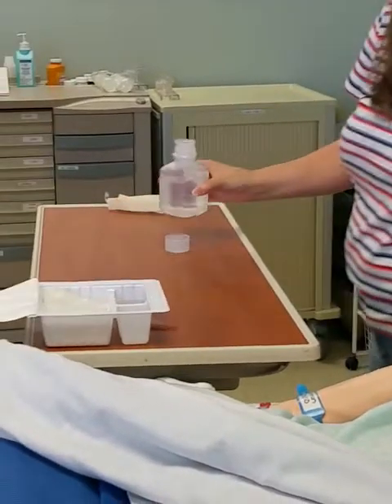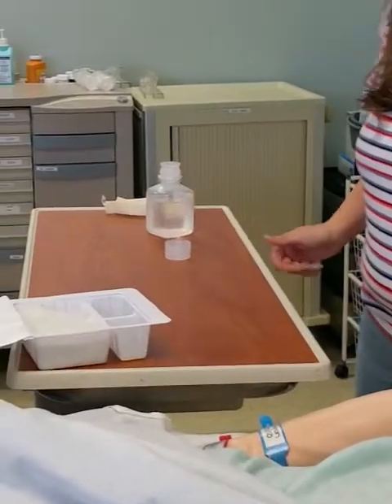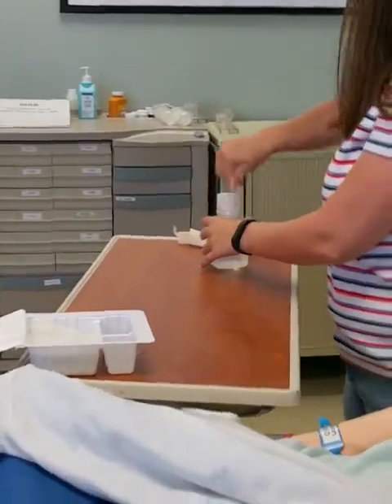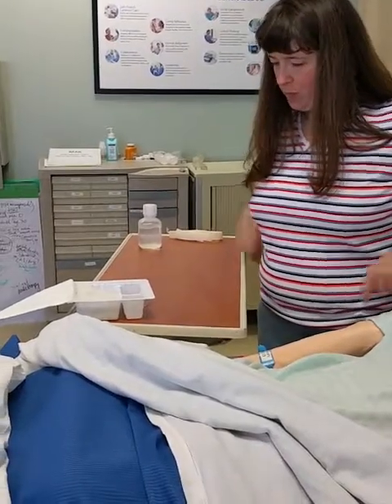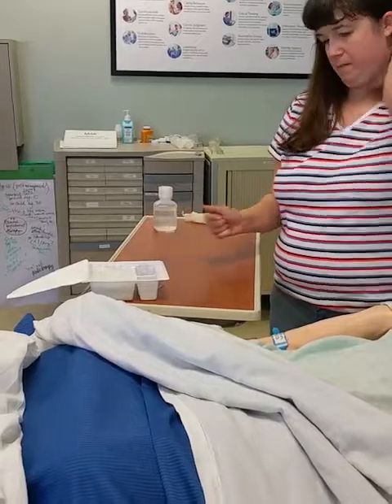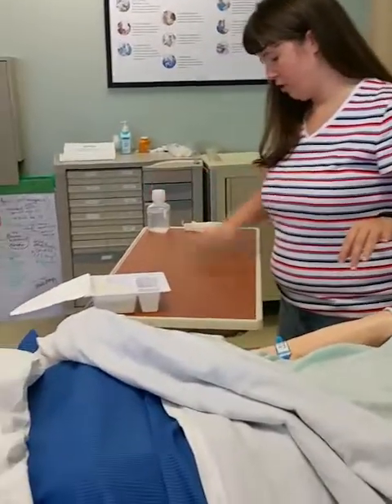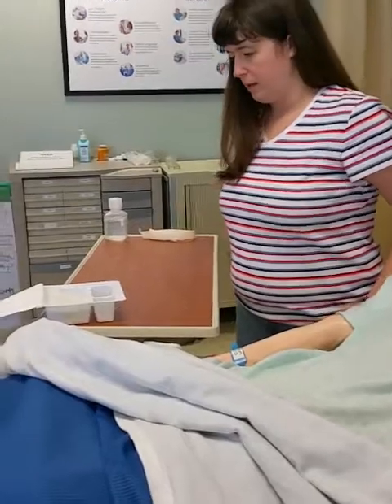Okay. Uh-oh. That's bad. Pretend that there is saline in that other one. Just check your kits before you go pouring solutions. Alright. Okay. So I've got hydrogen peroxide, saline on this side. Okay. Just making sure before I put my sterile gloves on that I've got everything fine.